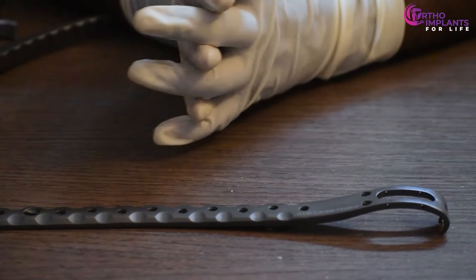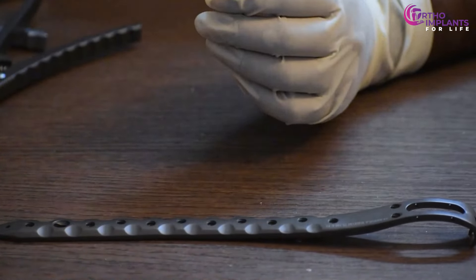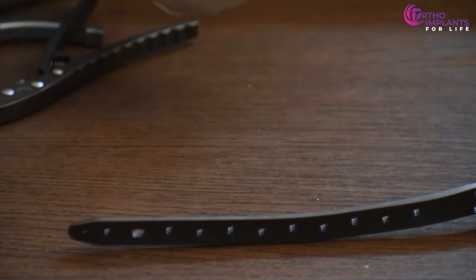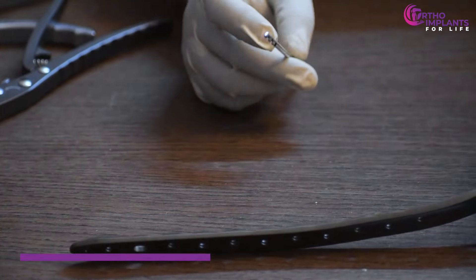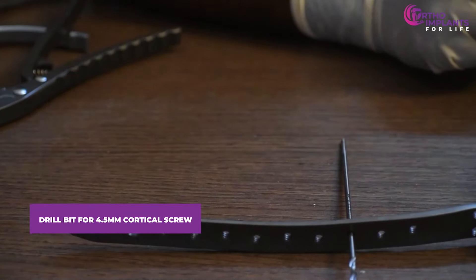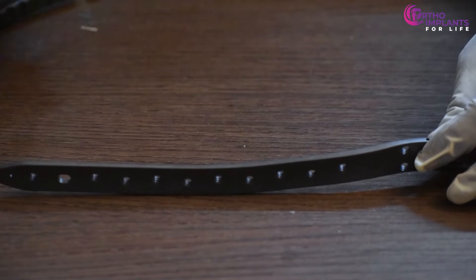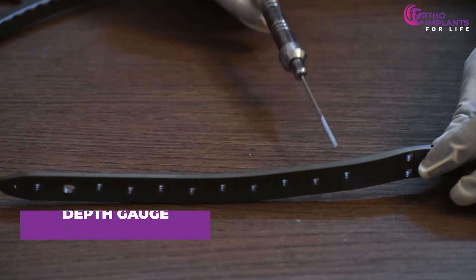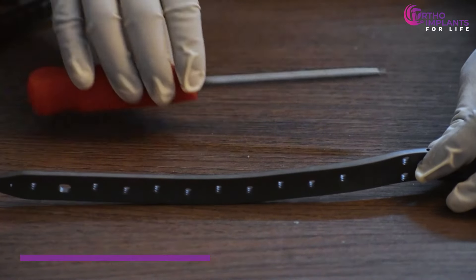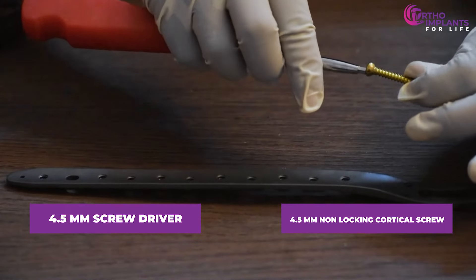Next, the plate fixation. The doctor decides whether a cortical screw is needed — it is required if the plate stays a little elevated from the bone surface. If required, we will first take a drill bit for a 4.5 mm non-locking cortical screw and drill through the hole where the screw is needed. After drilling, we use a depth gauge to measure the length of the screw required, then take a 4.5 mm screwdriver and fix the 4.5 mm cortical screw into the plate.